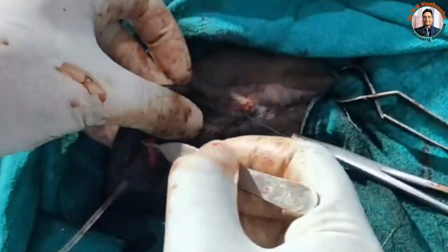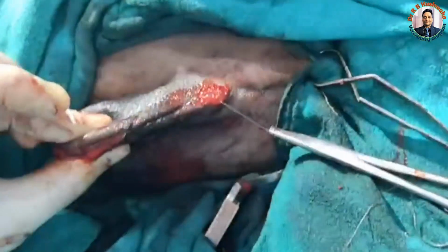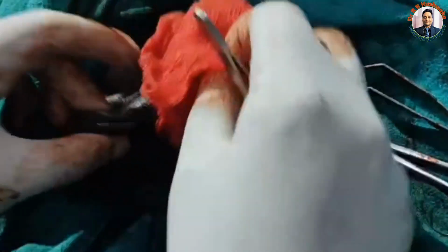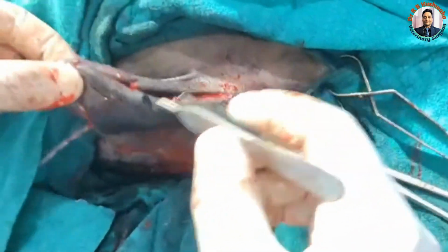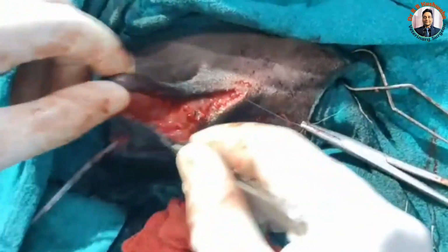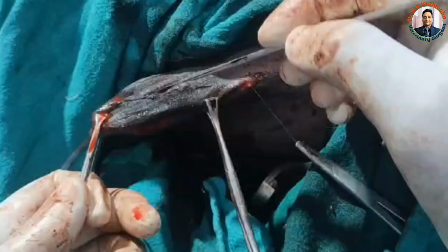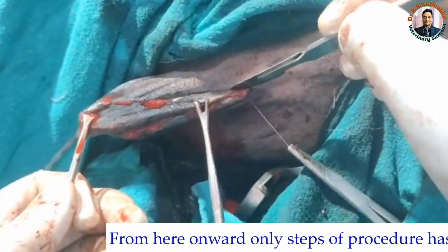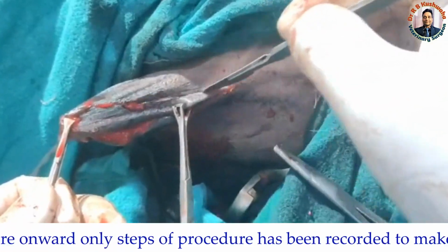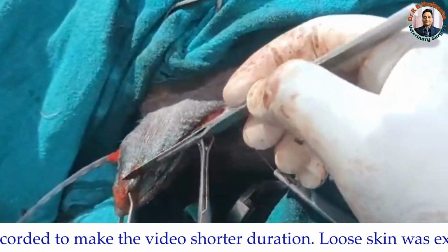But suppose if I repair the skin as such, there will be extra skin over the ventral aspect. So just to make a normal appearance of this area, I have to excise the extra portion of the skin also. So next I will incise from here up to this and this. So make an incision here. This one is the extra portion of the skin.